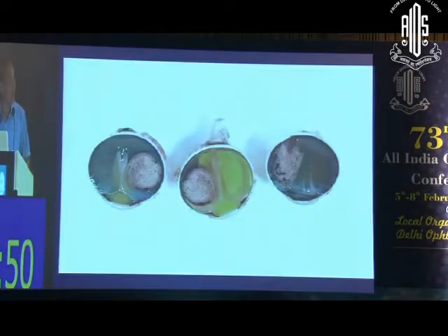So what could it be? It could be an amelanotic melanoma. Any other possibility? What is ciliary body made up of? Smooth muscle. So what is the tumor that arises from the smooth muscle? Leiomyoma. So this was a case of a ciliary body leiomyoma. And this is how an amelanotic melanoma looks. You see the mass is in the choroid, and you have complete retinal detachment, subretinal exudates.